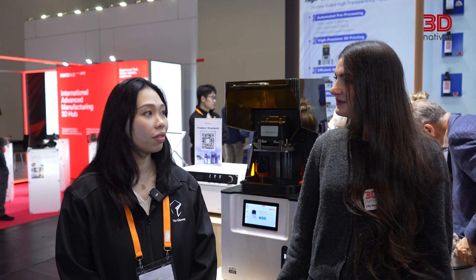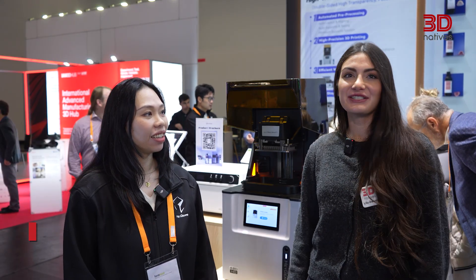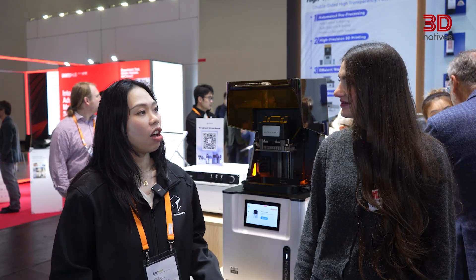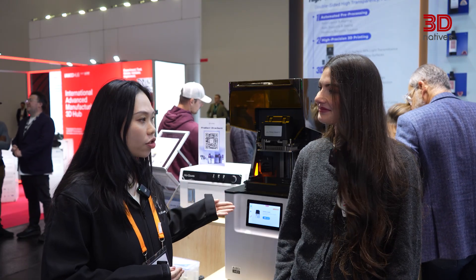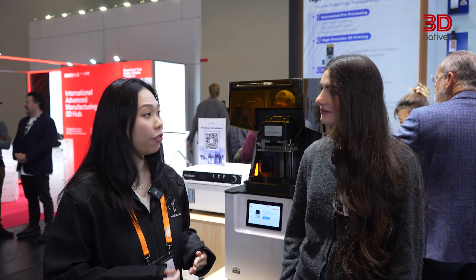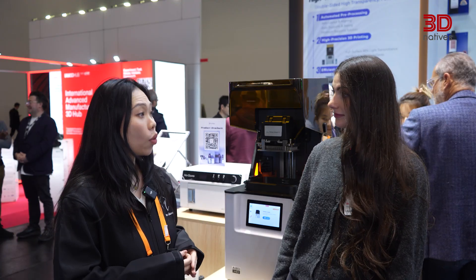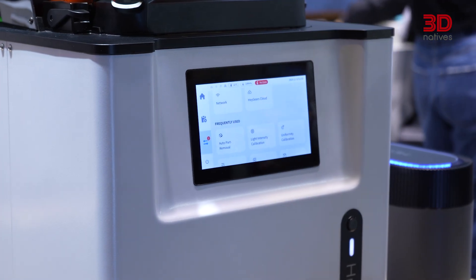Now we're going to talk about dental applications with Zara from HeyGears. Could you introduce the A2D HD desktop dental printer and what makes it stand out for professionals? The A2D HD is a newly launched printer with four key features. First, it's very large and fast — we can print five models in 20 minutes. Second, it features our own developed optical engine using DLP technology, which is fast, stable, accurate, and very reliable.